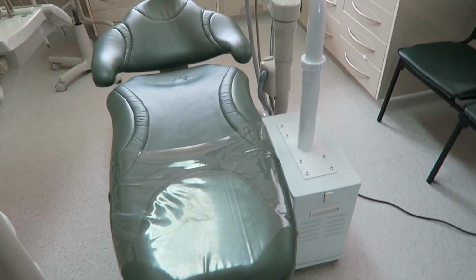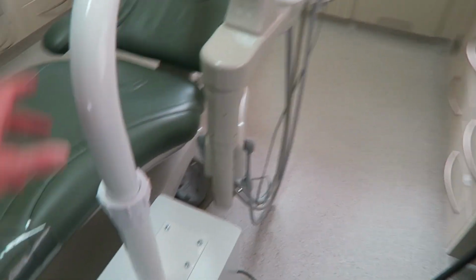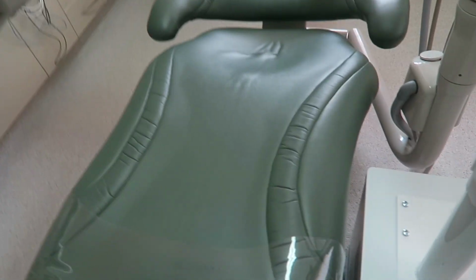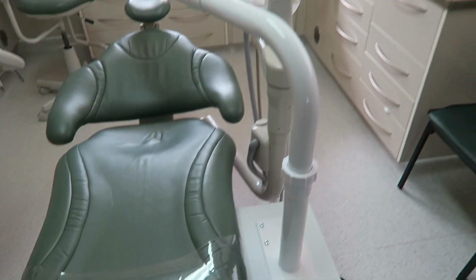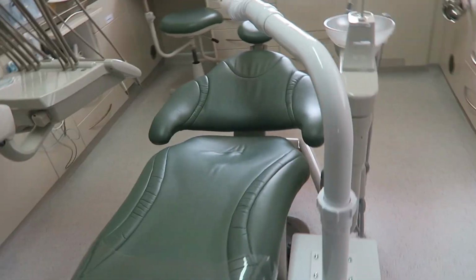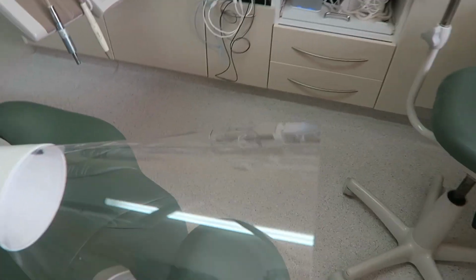Okay, so this is the positioning in my surgery, in the bigger surgery. We've got the DentalAir by the side of the chair. That can actually tuck almost right in underneath there, with obviously taking care that the actual base unit doesn't get in the way of the auto return on the chair. The top comes up nicely over the patient's face, like so.